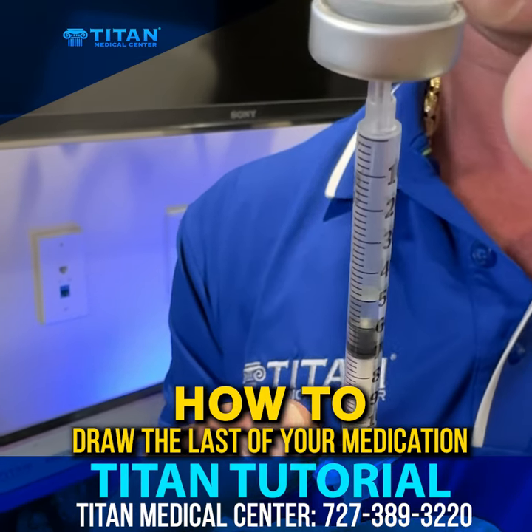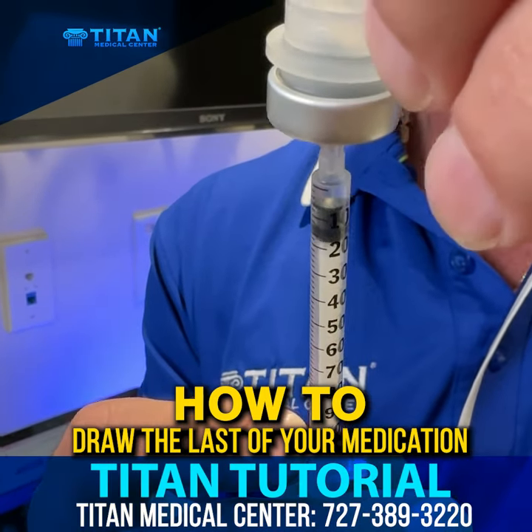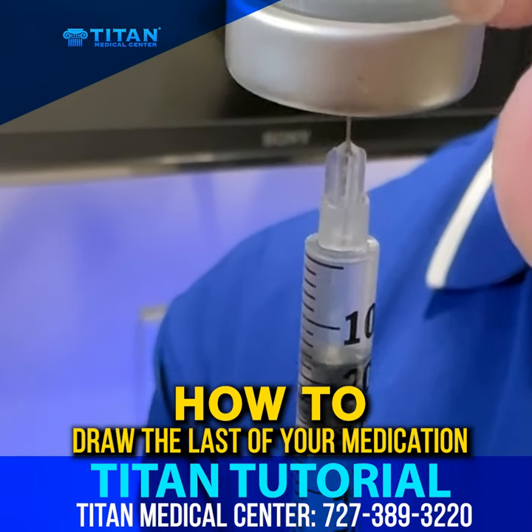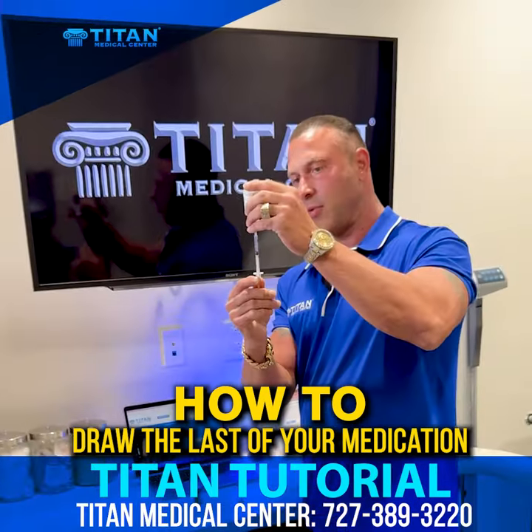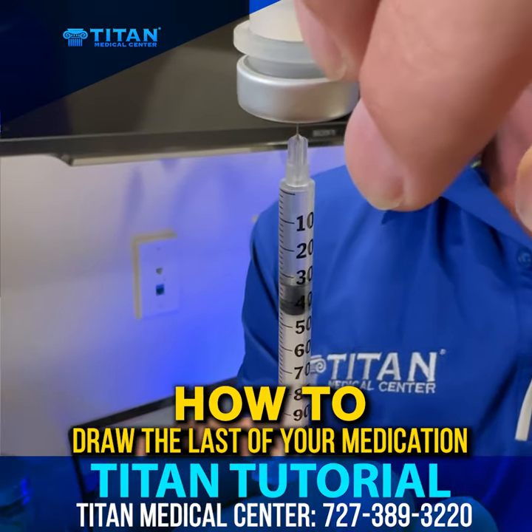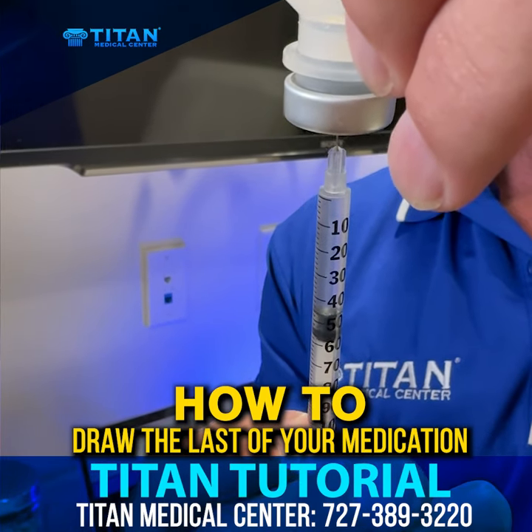So what you want to do if you're having problems like that is take the needle down just a little bit — about halfway from where it was — and now you can draw the rest of it in there. Real simple, real easy. Make sure that you get all the medication that was provided to you.